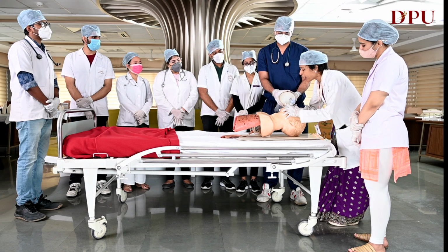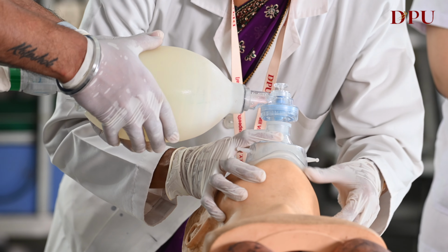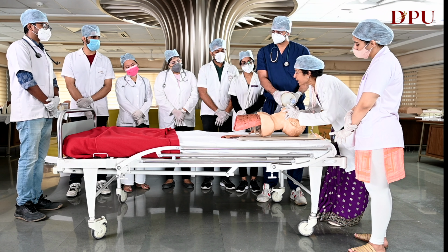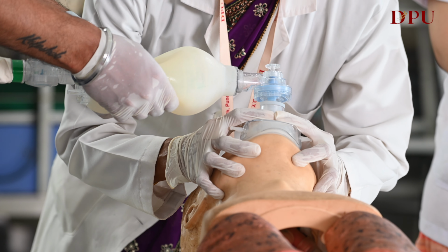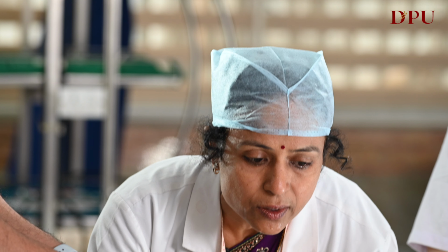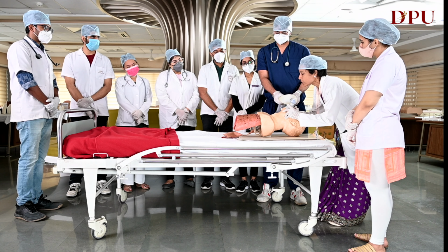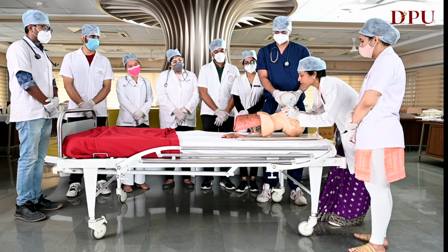Sometimes you are unable to get a good chest rise, in which case, if you have an assistant, you can go for the 2-person maneuver. Alok will help me in this. Look what I am going to do. I am holding the mask with both hands and making a good seal. This is how I have opened the airway. With 2 hands I am holding the mask. Now he will ventilate for me. Ventilate, giving 1 1000, 2 1000, 3 1000, 4 1000, 5 1000, 6 1000, breath.